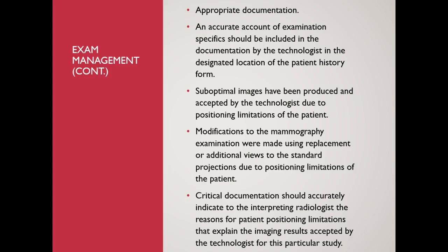We need to appropriately document everything. An accurate account of the examination specifics should be included in the documentation that is going on to the radiologist. So for example, if you did some extra views because a patient is confined to a wheelchair, make sure that the radiologist knows on the history form that the patient had special circumstances as being confined to a wheelchair.